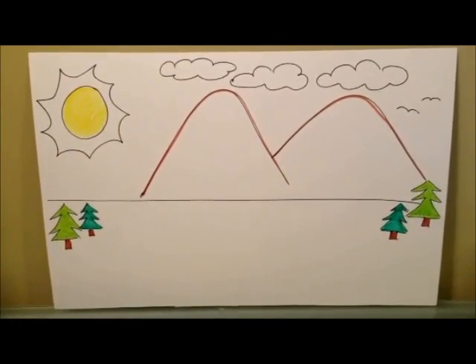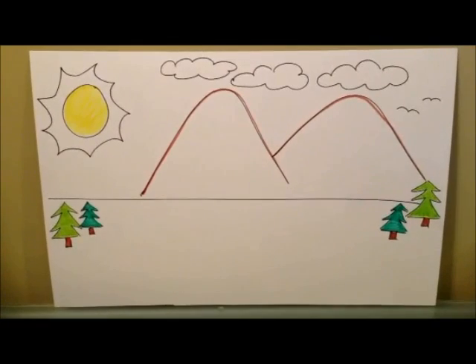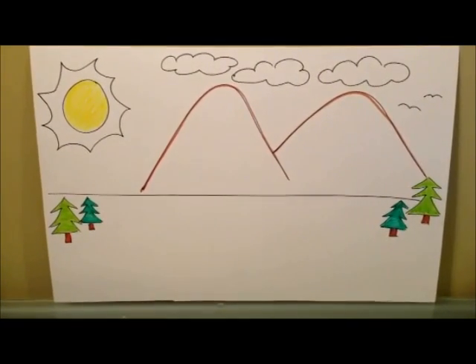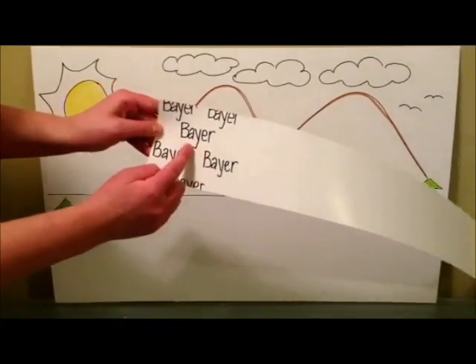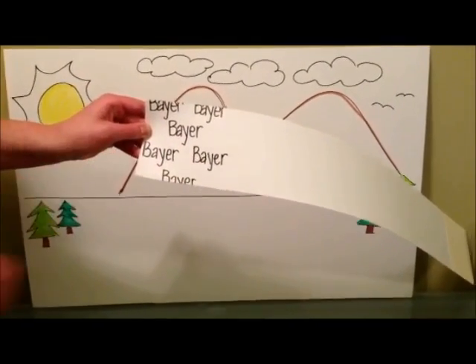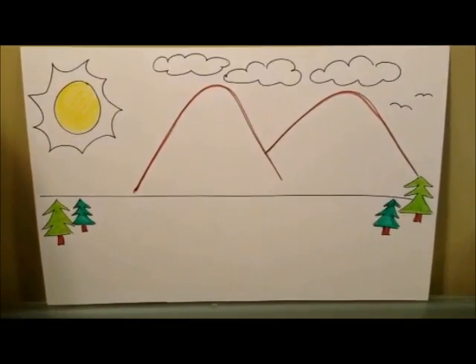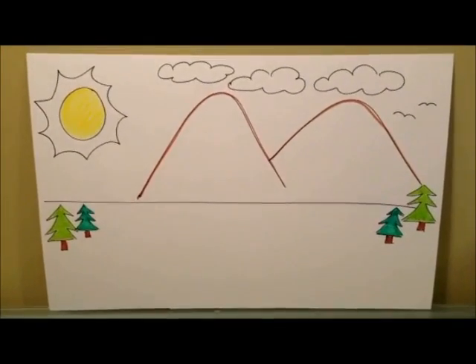You also want to make sure that you do not use expired strips, or use strips from a bottle that's been opened more than 6 months ago. Bayer strips tend to be recommended above all other brands because they do not expire quickly. Also, do not use discolored test strips.